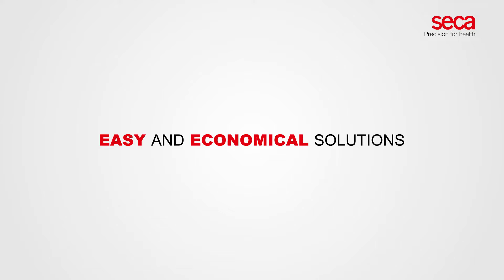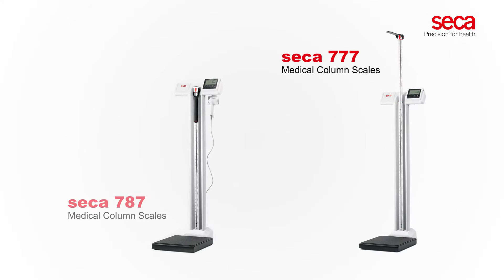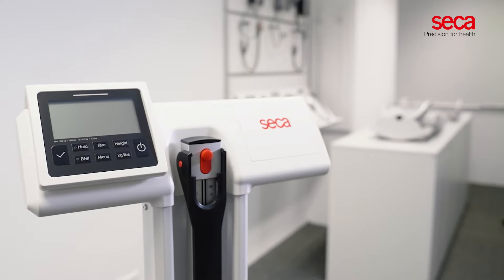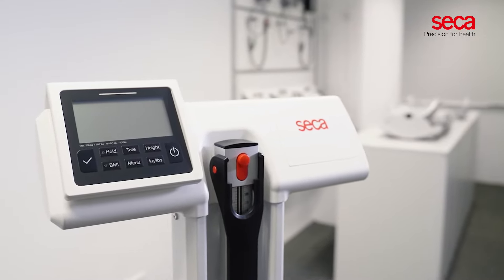Easy and economical solutions to assess weight, height, and BMI. The CECA 777 and the CECA 787 are medical column scales, perfectly suited for all types of healthcare settings.